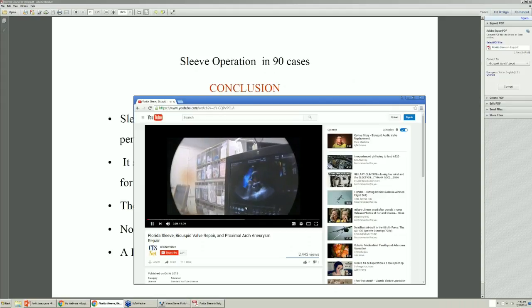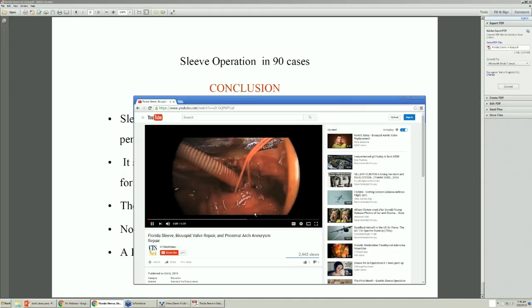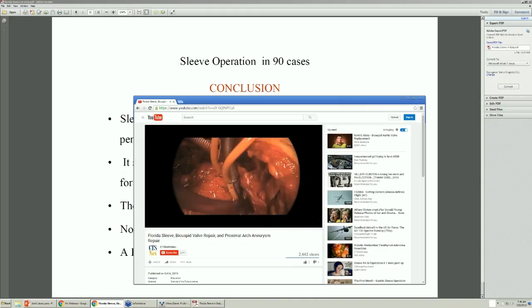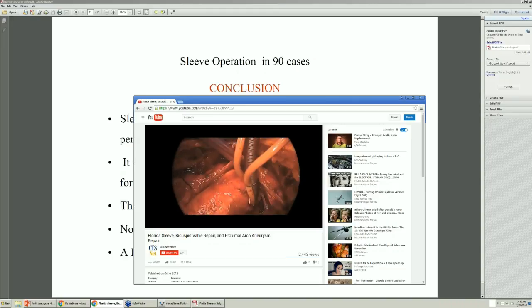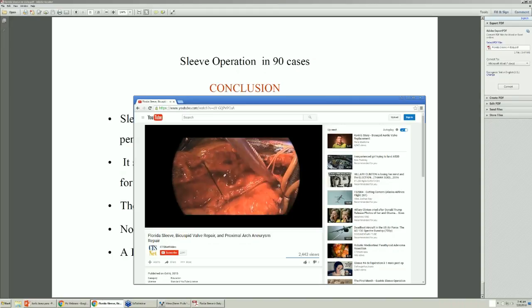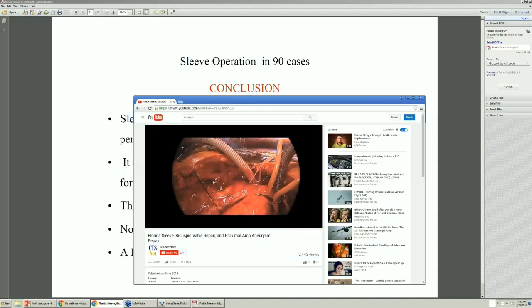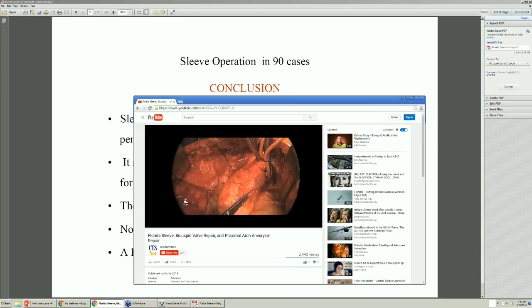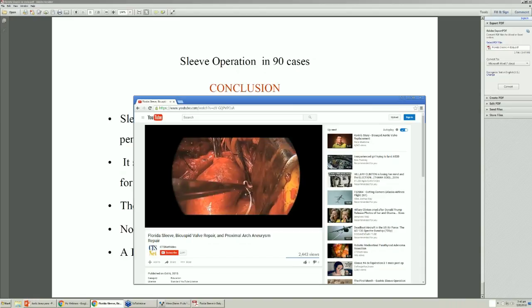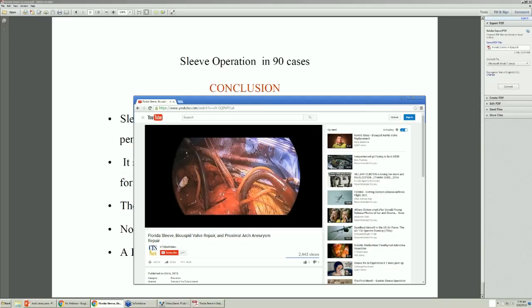Mild to moderate eccentric aortic insufficiency in a patient with bicuspid aortic valve and ascending aneurysm. Here we have dual arterial cannulation. The innominate artery is cannulated through an 8 millimeter graft, and the aortic arch itself beyond the left common carotid artery. Here we're exposing the innominate and left common carotid arteries and see the cannula distal to that. Next, we are dissecting the aorta a bit further between the innominate and left common carotid, and we'll pass an umbilical tape between these arteries, which is going to help guide cross-clamp placement.